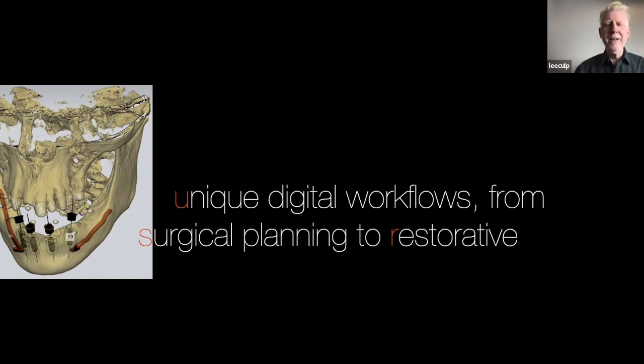When I was working with Ivoclar, I'm like, why do we do bite blocks? Why don't we just make teeth? Why don't we just skip the bite block thing? If we know, we can adjust it, we could grind it a little bit. But my mind, not being a denture technician, the bite block thing just digitally didn't make sense. I'm like, let's just put some teeth in there. It's funny though, because in the removable world, that's what we did. We started with a wax block. But you're right, in the digital world, it makes no sense.